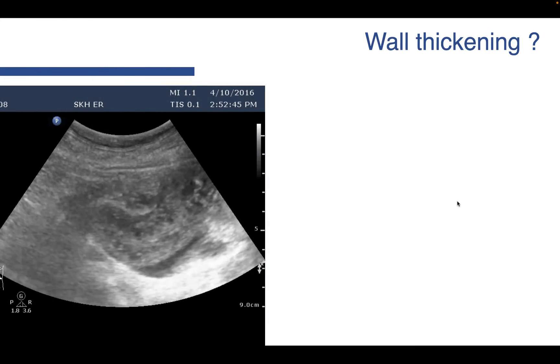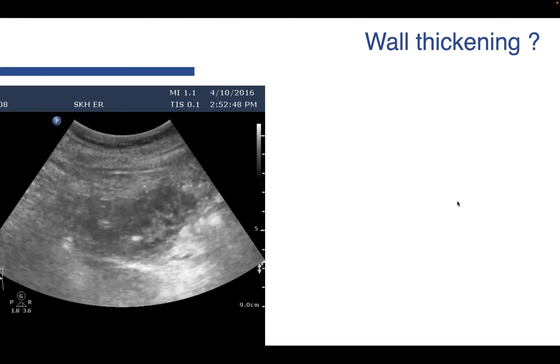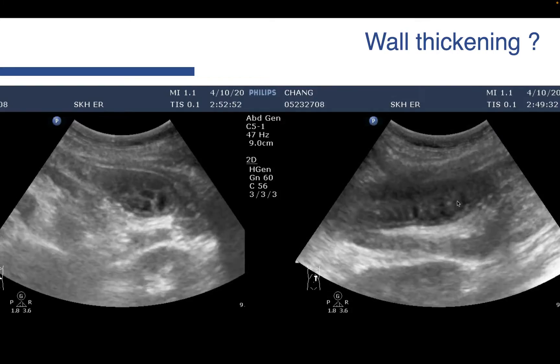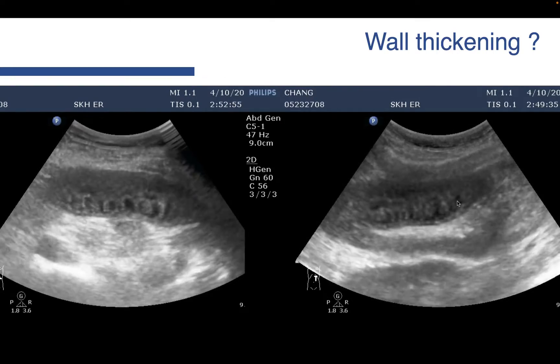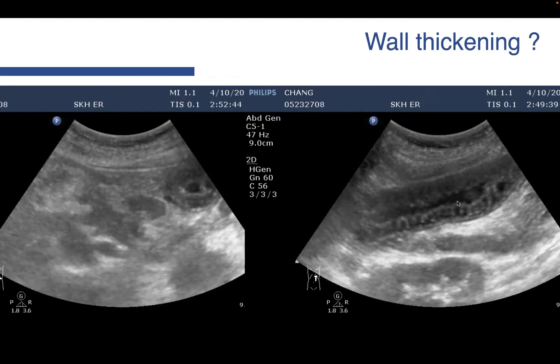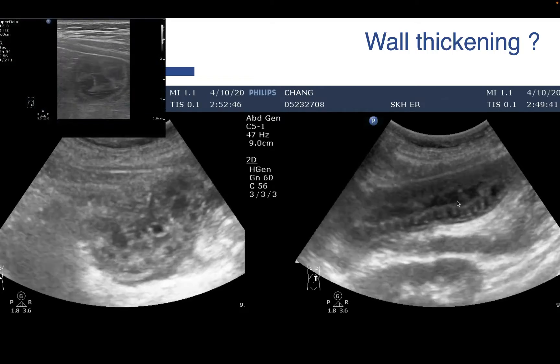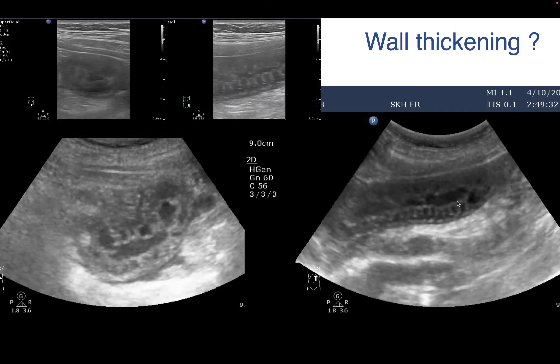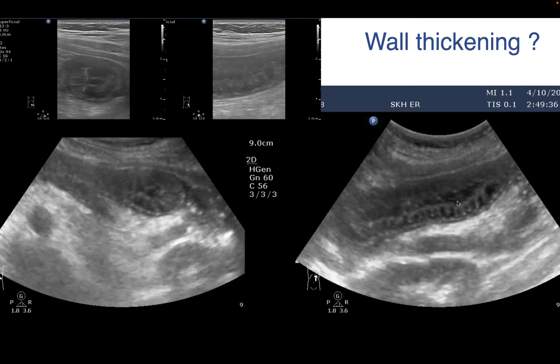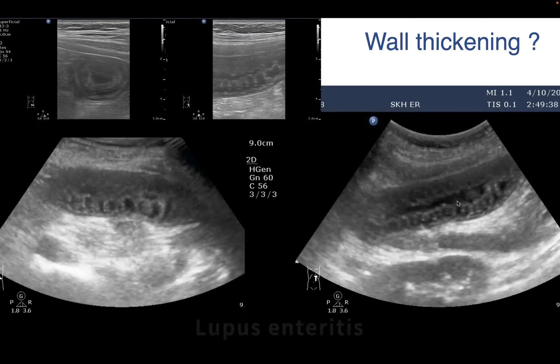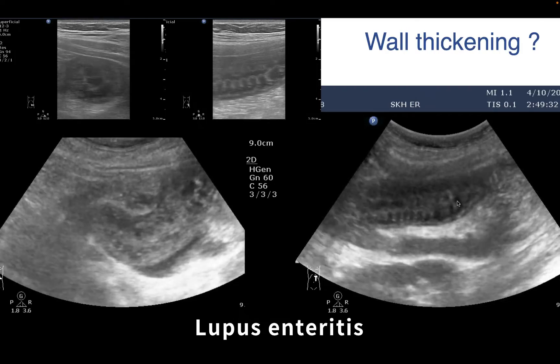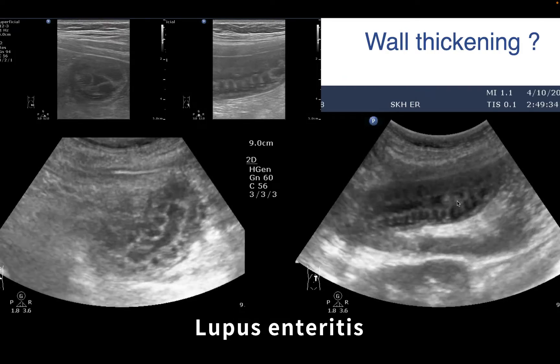The other wall thickening: let's look at these bowel loops. It looks like a fold of Kerckring, but the fold is too fat — it is not a typical fold of Kerckring. When we see these patterns, use a linear transducer. The pattern is quite obvious — those folds of Kerckring become edematous. When you have patients having this presentation, you should always consider some immunocompromised situations. In this patient, lupus enteritis.